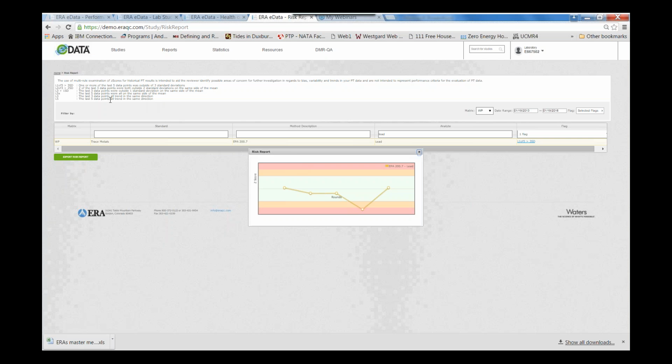Now, if you have any questions about this report or any of the other reports that we looked at today, I'd encourage you to contact ERA, contact our customer service team or your salesperson. And we would certainly be happy to go through this demo in detail with you, take a look at some of the details, and perhaps talk about some of the challenges that you're working on in your lab, and identify how these tools can help you by making your job easier, helping you save time by using automation to review flags and to evaluate your performance.